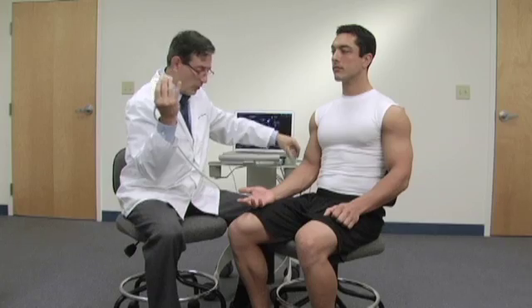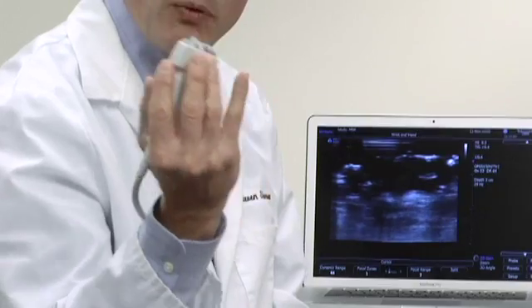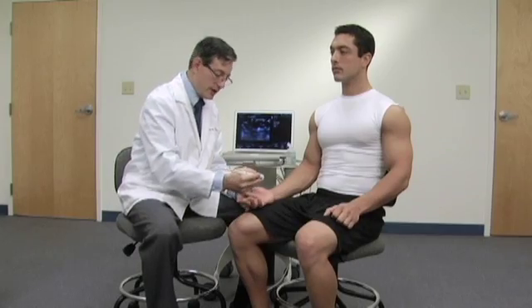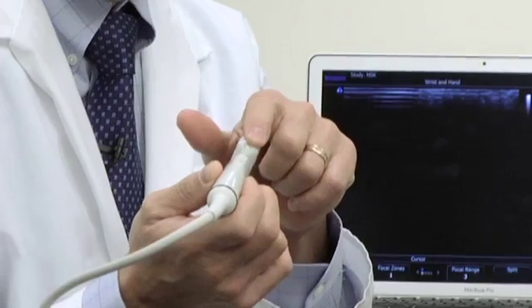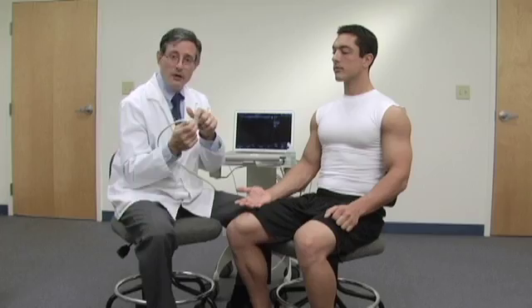As we discussed earlier, holding the hand properly is very important, so I want to make sure that I get my hand down on the patient to control the ultrasound probe. Continuing with the probe basics — also called transducer basics — you should be aware that there is a notch on the probe. The notch on the probe aligns to the left side of the screen.